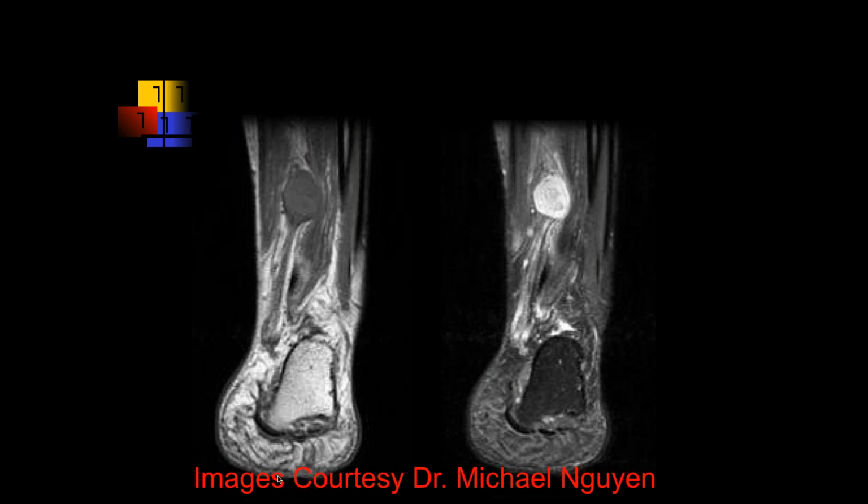Okay, we got two coronal images of the ankle. It looks like we have a round slash oval mass, which is T1 iso to muscle, but PD hyperintense. We can't really see it on the projected screen, but we can see it nicely on the computer. There's actually inhomogeneous signal intensity with this, as opposed to the cyst that we saw before, which was very homogeneous.